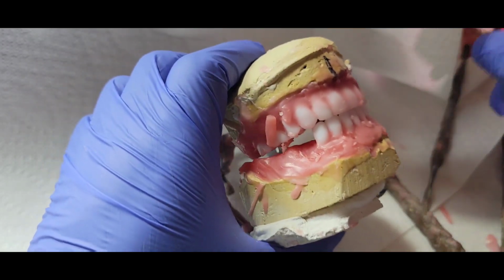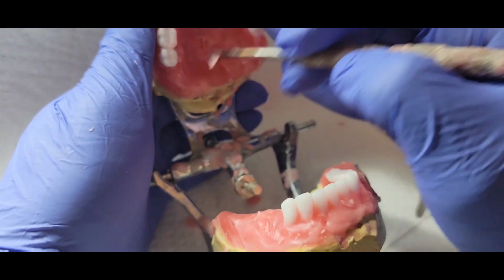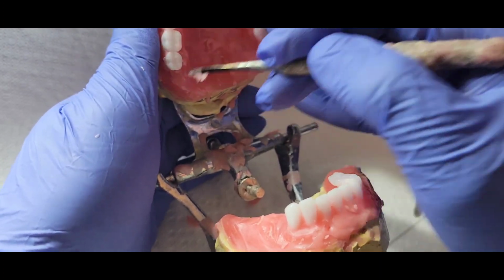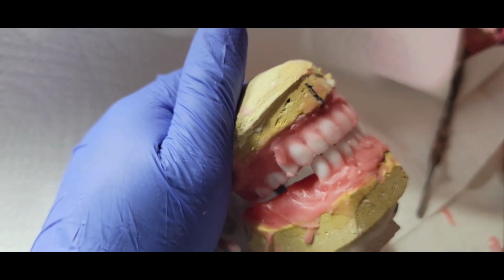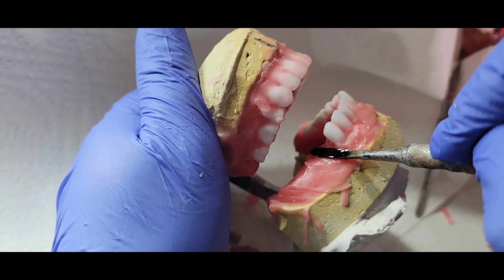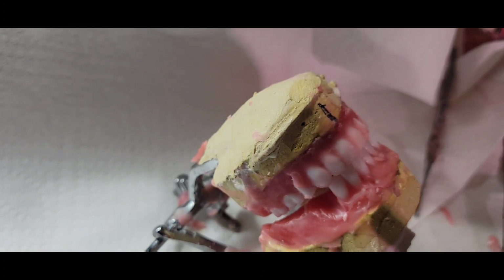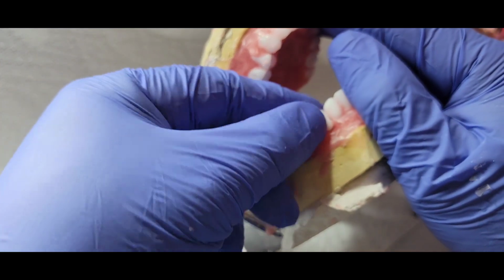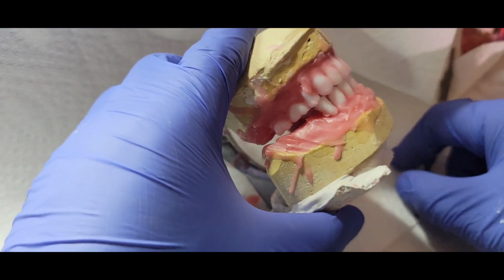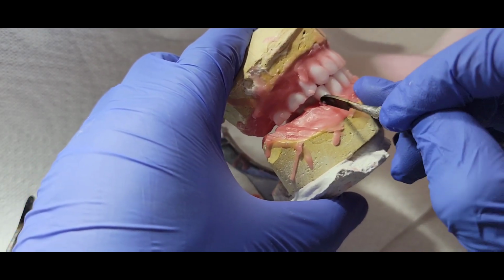This is the main goal here, to have a tight occlusion. So make sure to have your occlusal, which is the inside of your teeth, free and clean. Those are some of the more important things you have to be aware of, to make sure everything you're doing is spotless and clean when it comes to the occlusion part. Let's try to do that by the end. As you see there.